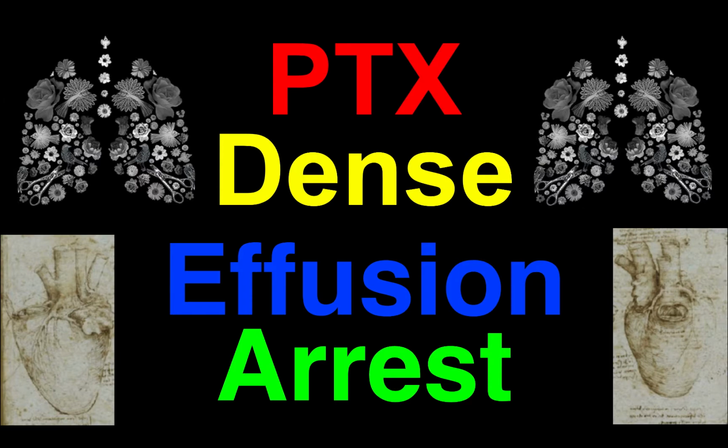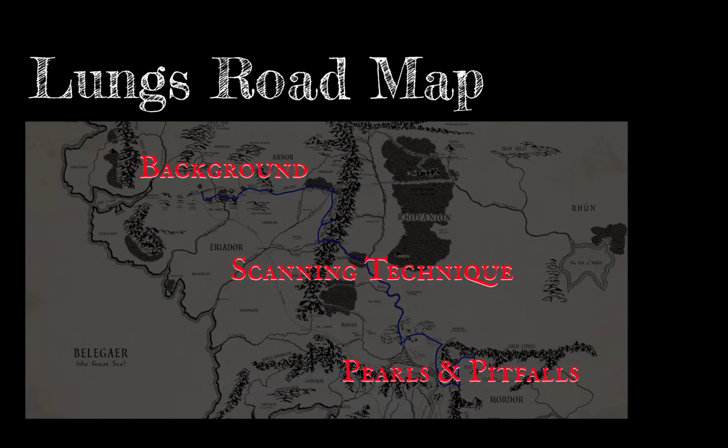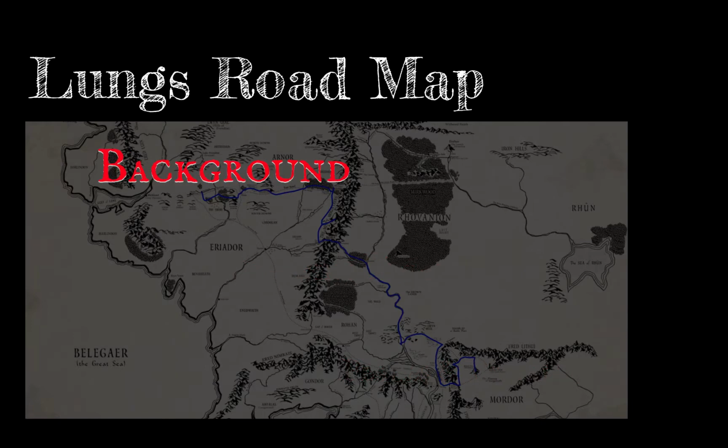So let's get started with the lungs. We'll start by talking about some background concepts, then the scanning technique itself, and then some pearls and pitfalls of this particular scan to prevent you from falling flat on your face. Let's start with the background.